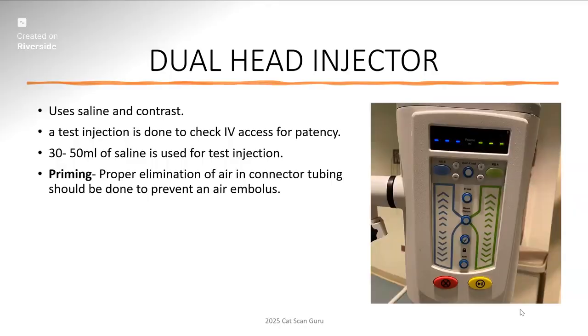So this is a MedRad Stellant. Ever since this picture, our facility did upgrade to the Stellant Flex. I don't know, the jury's out for me on that one, because with the Flexes, we've been having some issues with it. So we use saline and contrast.